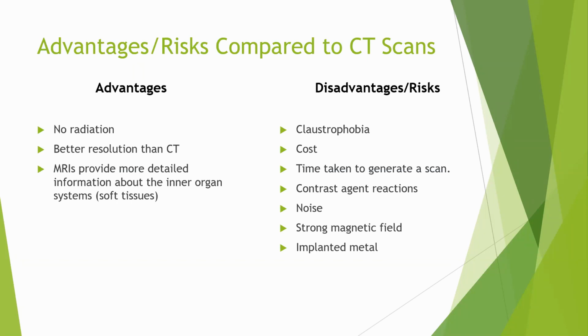So my thought process is, if I need to do an MR, it would be best done on a regular MR and not a standing one or an open gantry system. It is obviously expensive and time-consuming, and needs a contrast agent. Contrast agent reactions can also occur with CT scans, and anything X-ray can also be done with contrast medium. You don't want to introduce radioactive dyes in your body. It probably will not have much effect once or twice in your lifetime, but if you keep doing it, it is obviously not good at all.